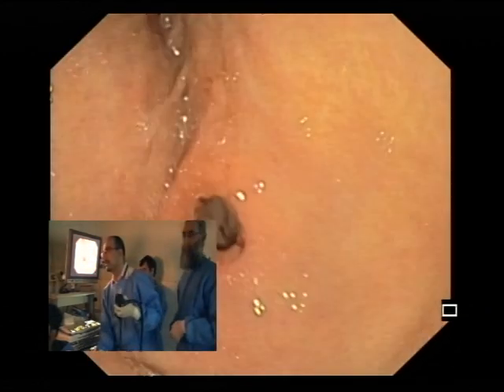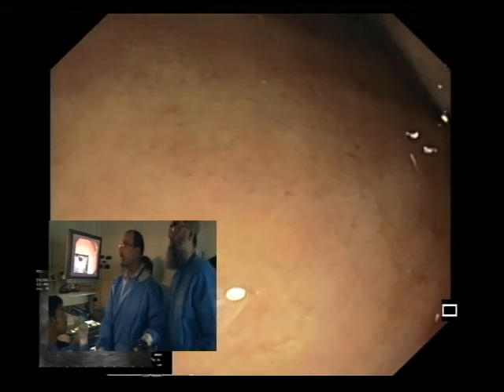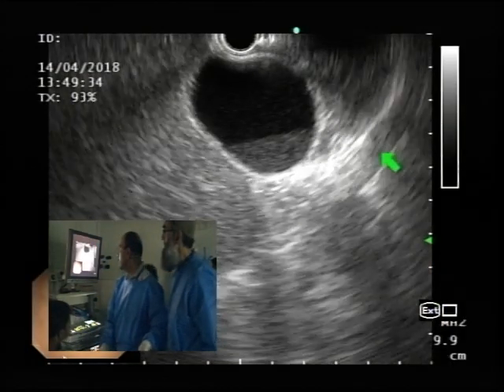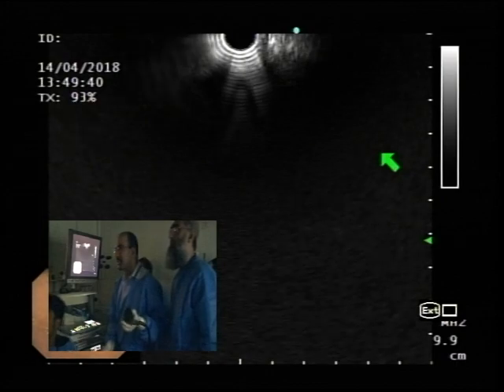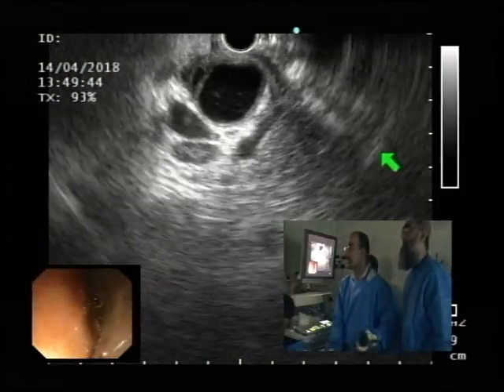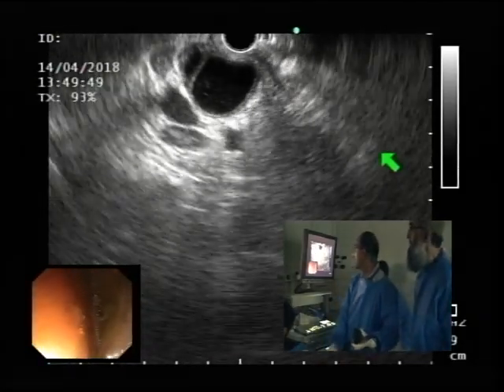First, I just wanted to demonstrate that you can look at the gallbladder with ultrasound. Do you see that bulge? Enlarge it. So you can see layering sludge in the gallbladder from the gastric antrum. Second, going through your view again, this is the bile duct, which has sludge in it. You can see layering sludge in that.